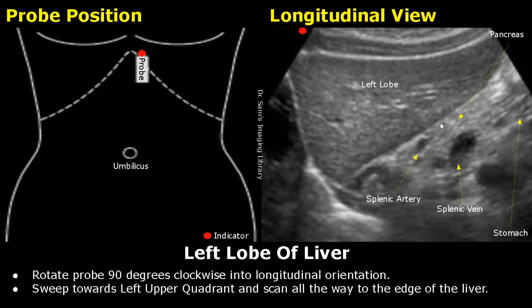This small, round, anechoic structure is the splenic artery. This large, rounded structure behind the pancreas is the splenic vein. The stomach may also be seen.